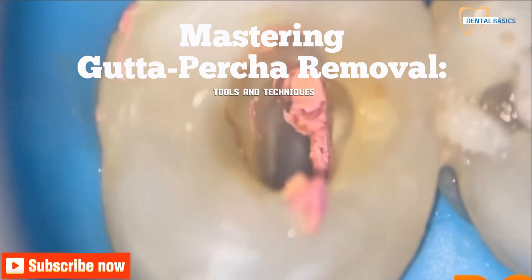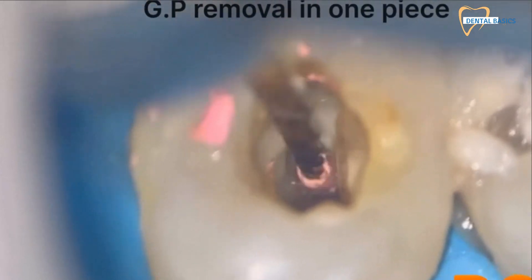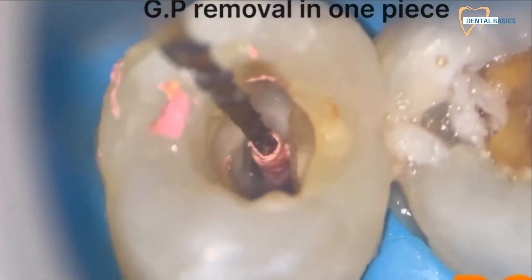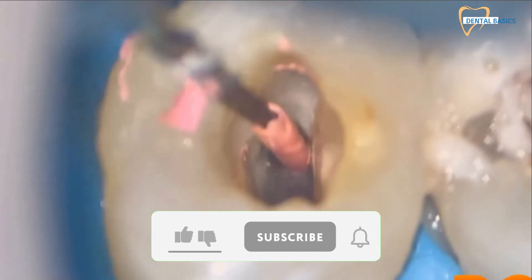Welcome to our video on gutta percha removal during endodontic retreatment. Gutta percha can be challenging to remove. In this video, we'll explore the most effective tools and techniques for its safe and efficient removal.